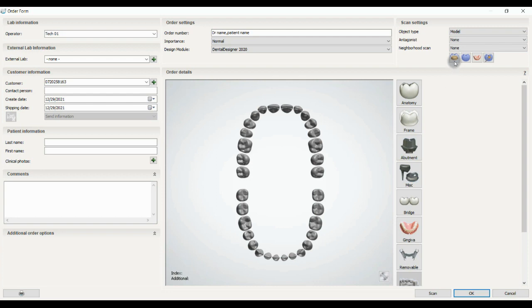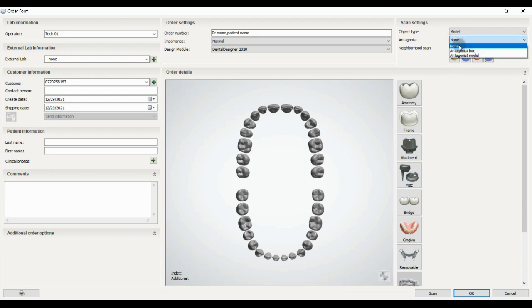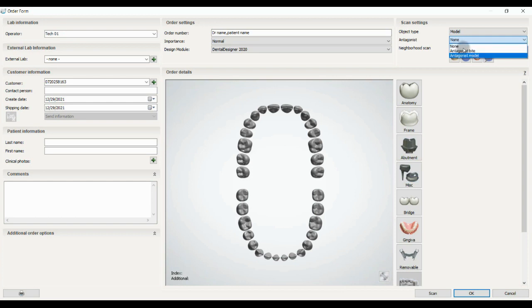The next one is antagonist. You have three options: you can have no antagonist, or you can have antagonist with bite, or you can make a model from your antagonist and import it.